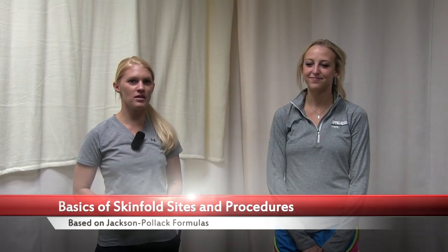I'm Tracy Haynes, here at Appalachian State University in the Exercise Science Department. I'm Grayson Johnson, a student at Appalachian State University. We're going to go through how to perform a seven-site skinfold measurement, covering different angles for taking measurements and caliper etiquette. I personally like the Lange calipers — with a smaller hand I can handle them better than some of the larger plastic calipers.